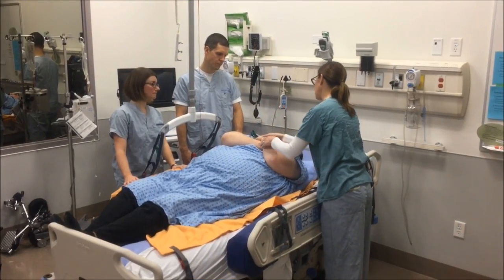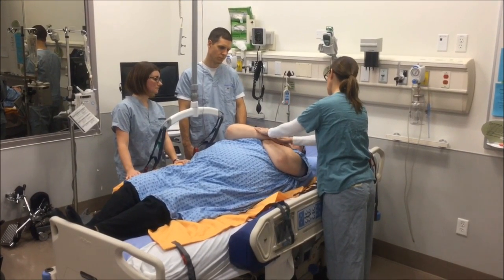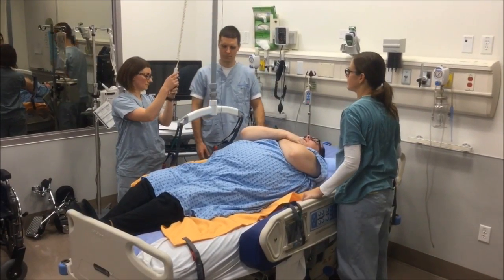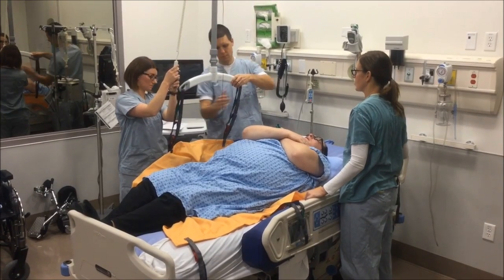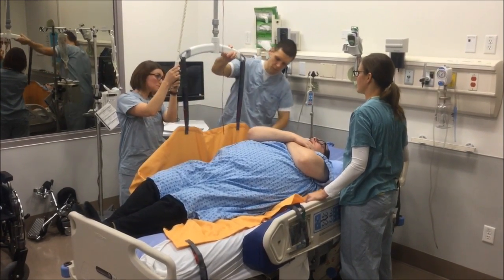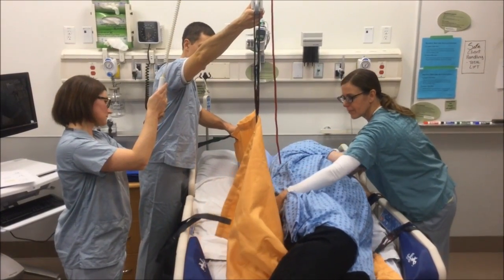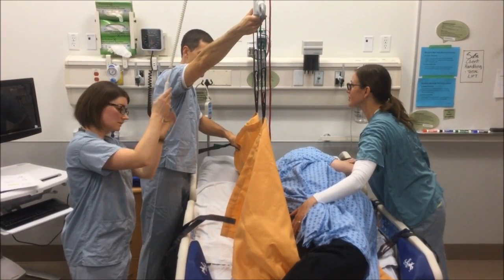Talk with the client and prepare them for the log roll, advising them to keep their arms within the sling and, if able, to cross their arms on their chest. Apply tension to the sling and verify that the attachments to the spreader bar are correct. Also check that the client's skin is not being pinched and that their limbs are in a safe position. The worker operating the lift continues to raise the spreader bar while the other worker guides the client to log roll into a side-lying position.